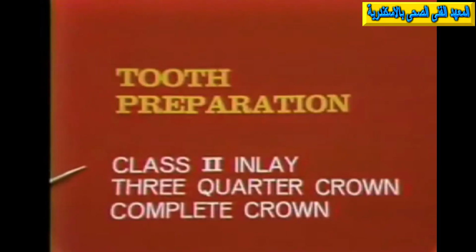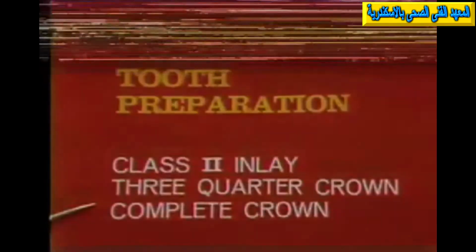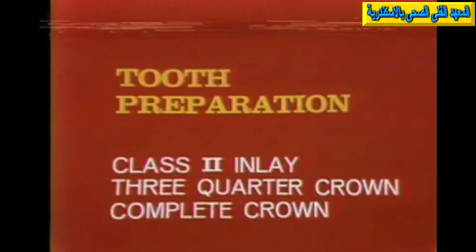The semi-rigid connector would normally probably be used with a Class II inlay, possibly with a 3/4 crown, or even a complete crown. Now, there are special things to watch in each of these. In the case of the Class II inlay, it is important in cutting the proximal box to recognize the need to create sufficient space for gold large enough to receive the semi-rigid connector to accept the keyway part.